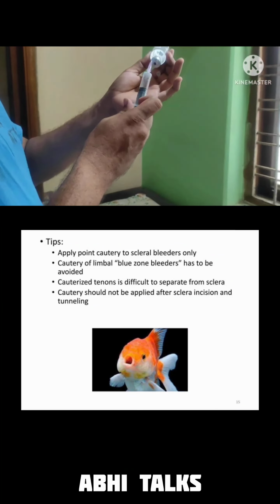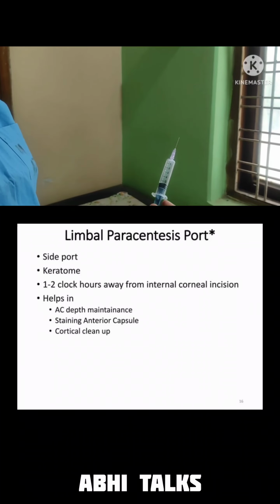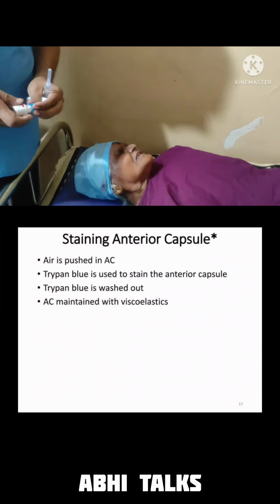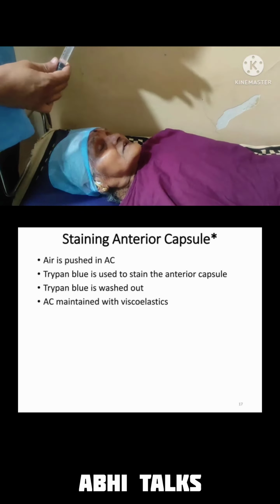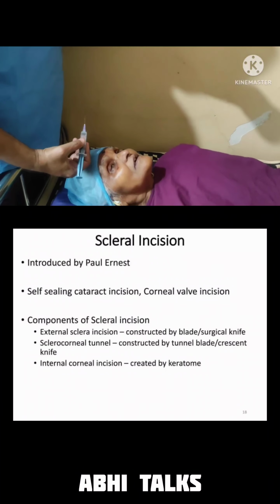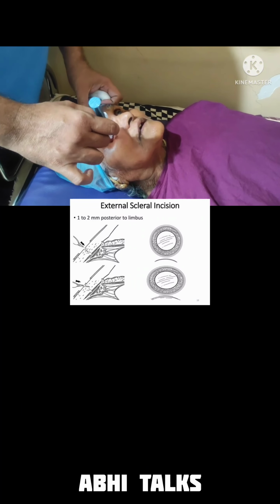Patient's eyes are anesthetized with paracaine eye drop. Patient is instructed to look straight in primary gaze. Now the first lower lid block is given. The lower 2/3, that is medial 2/3 and lateral 1/3 junction point is palpated and gently the block is given. Needle is directed backward, posteriorly and downward. We have to make sure that the needle is not in any major blood vessel, so we have to withdraw it. If there is no blood, we can slowly push the anesthetic solution.